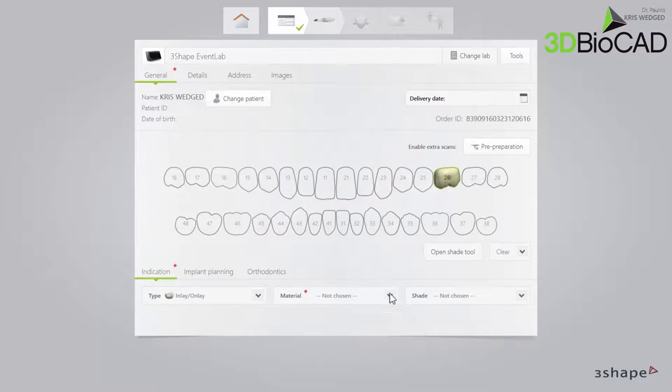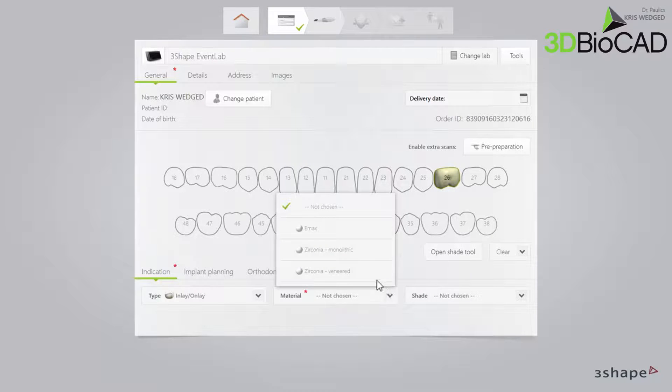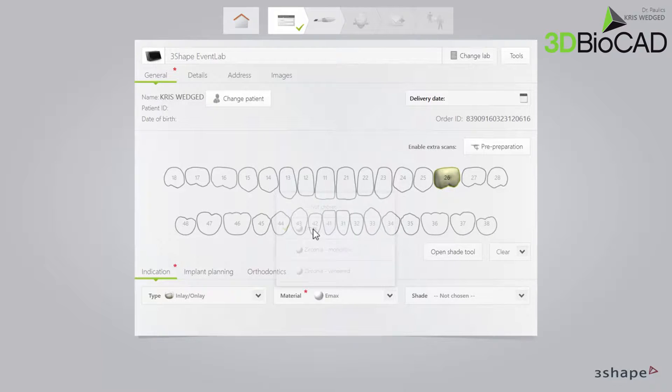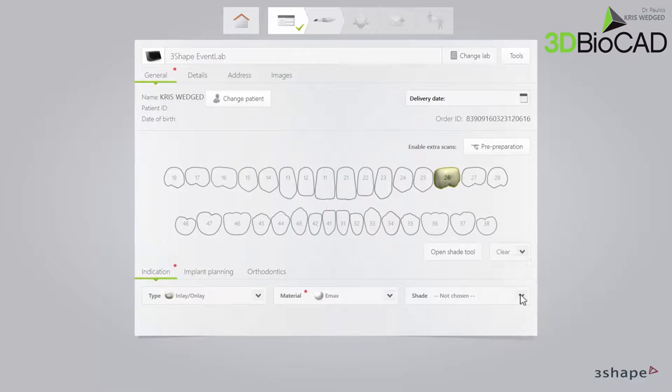Then select Material in the Material drop-down list. And if you have a predetermined shade, select it in the Shade drop-down list.